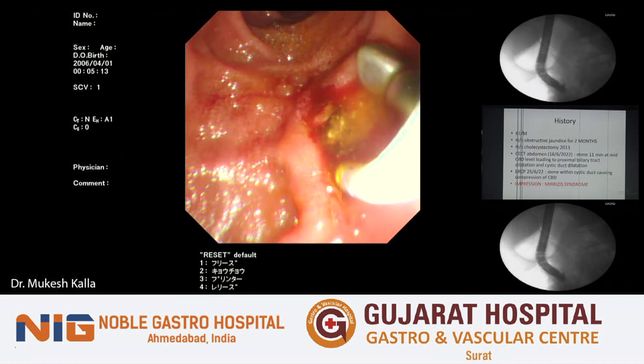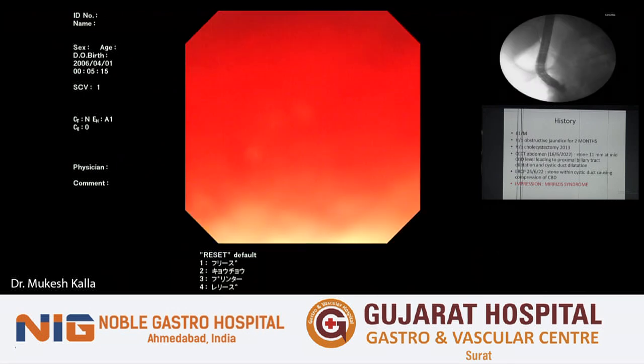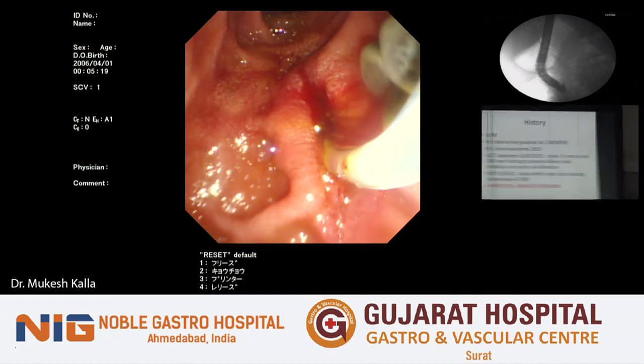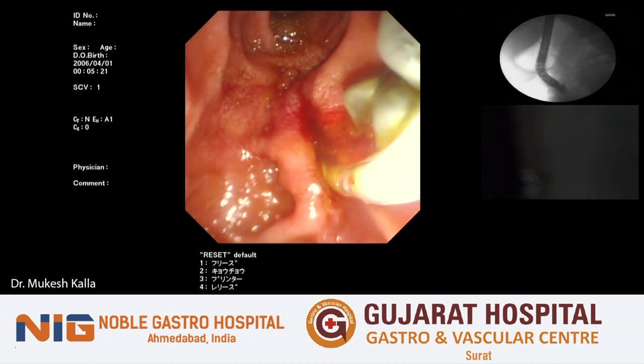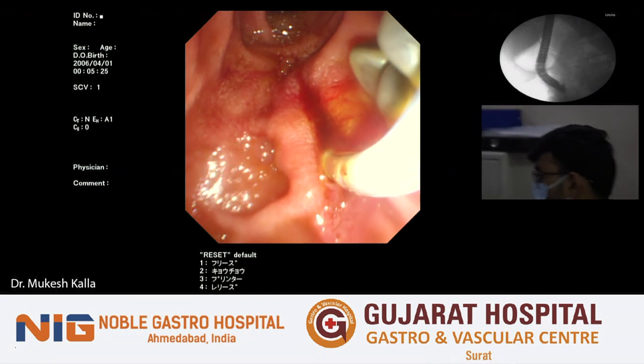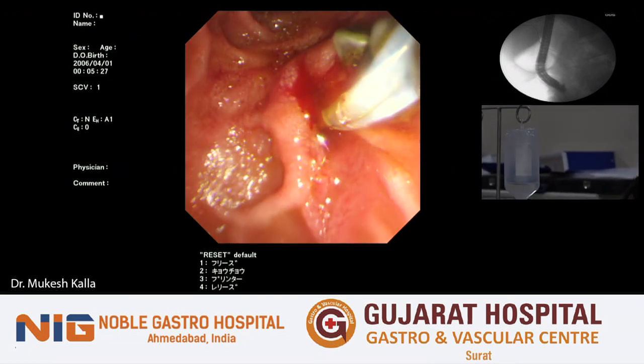Yogesh has been kind enough not to give me a large stone, but all small stones in the cystic duct. So, because this is a learning area here for us, I would like your concentration on the laser as well, because you've just seen the EHL.